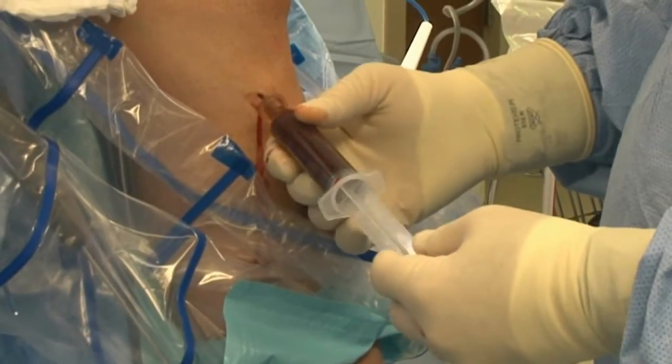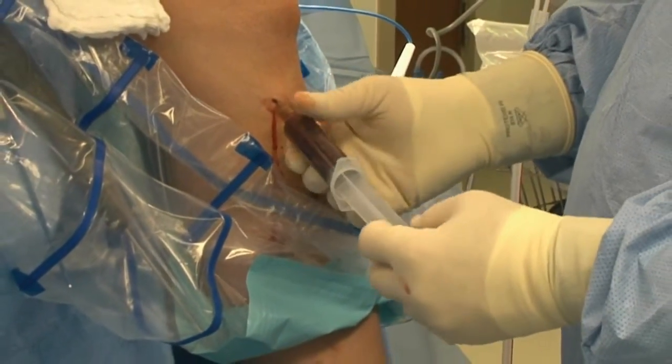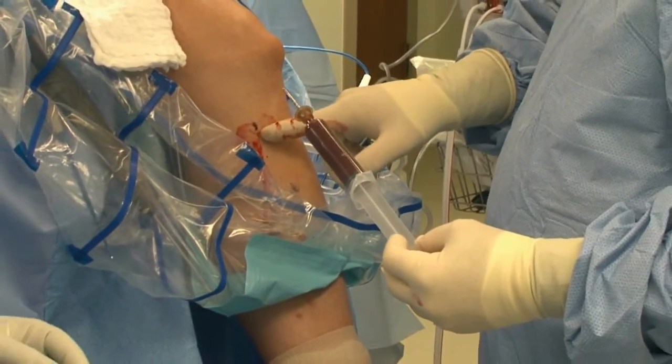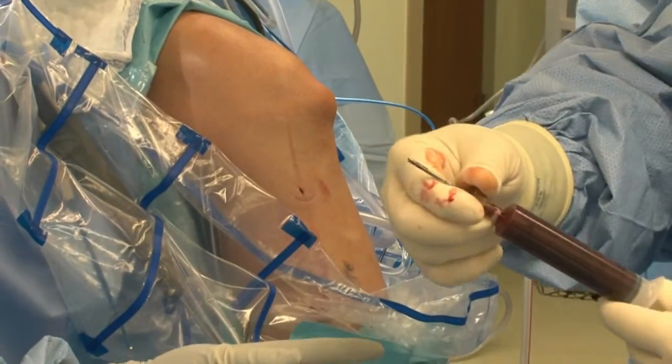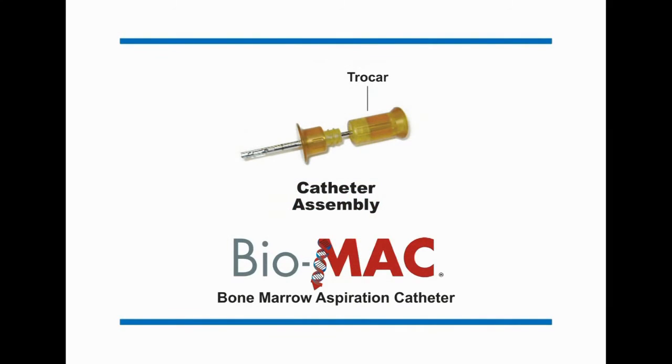Step 10. When the desired amount of marrow has been obtained, remove the Biomac catheter by applying gentle outward traction while rotating syringe and catheter clockwise. Once the Biomac catheter assembly, plunger, and drill adapter are no longer needed, discard in an appropriate sharps container. Note: the Biomac catheter may also be removed by removing the syringe, securely reattaching the trocar, then applying gentle outward traction while rotating catheter assembly clockwise.